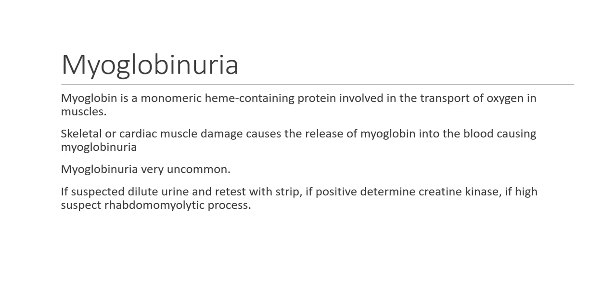If myoglobin is suspected, dilute the urine and retest with the strip. If it's positive, then perform a creatine kinase, and if that's high, you may also suspect a condition called rhabdomyolytic process. Sorry, I had a real hard time with that word.